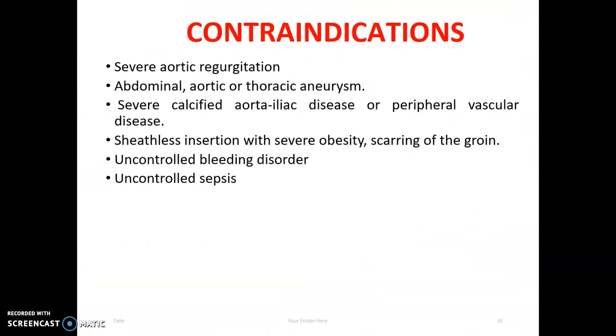The IABP procedure may be contraindicated in various conditions like severe aortic regurgitation, abdominal, aortic, or thoracic aneurysm, severe peripheral vascular disease, uncontrolled bleeding disorders and uncontrolled sepsis.